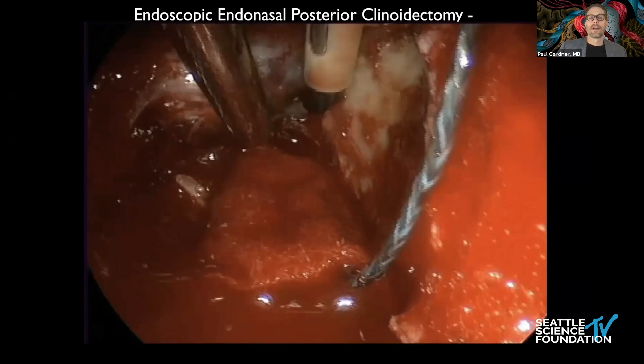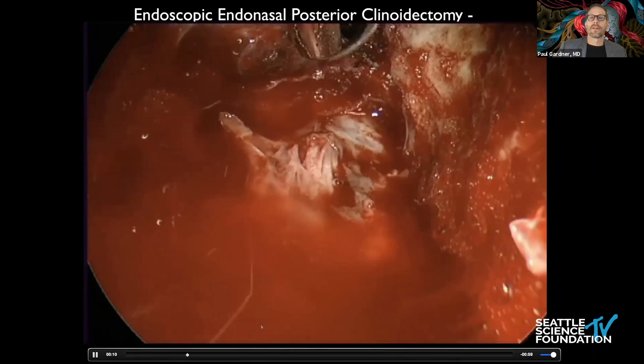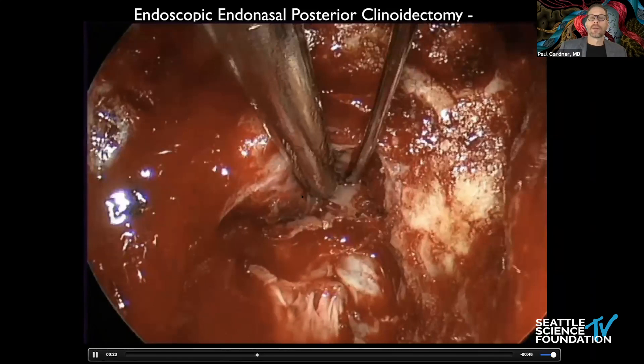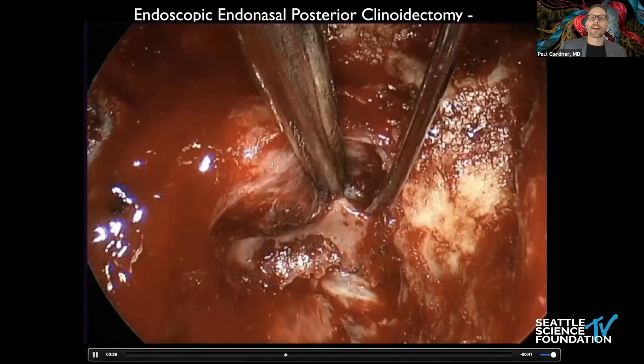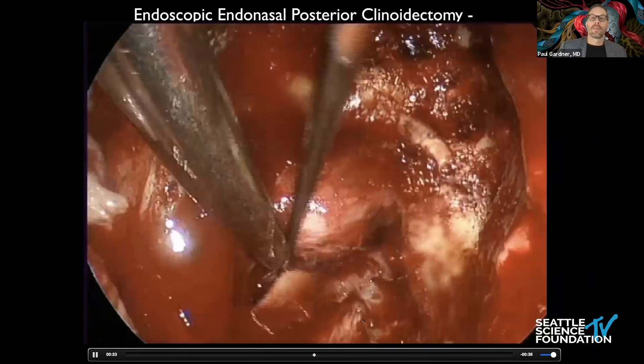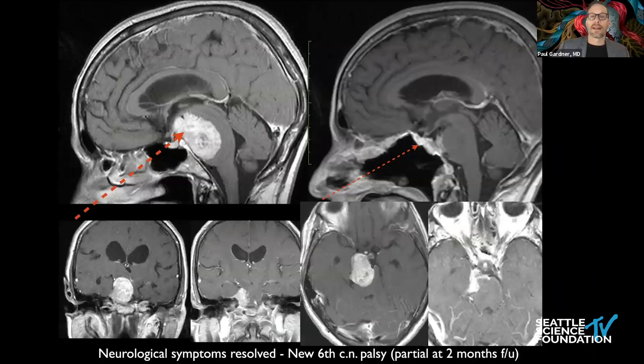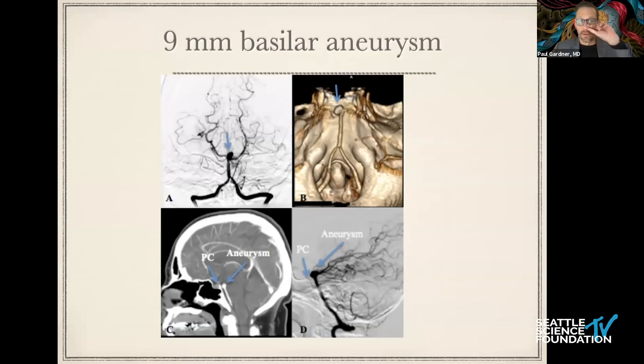For a case going up behind the sella, we can very clearly access that. Here I'm coagulating and then cutting to gain access to the posterior clinoid, coagulating and cutting the inferior hypophyseal artery. I'll usually use a Kerrison to split the dorsum in two. The posterior gland does not have the same dural sac around it that the anterior gland does, so there's a higher risk of DI in this setting. Here you can see the access we can get for a pretty nice resection of this petroclival meningioma, and this can also be used for a basilar aneurysm.